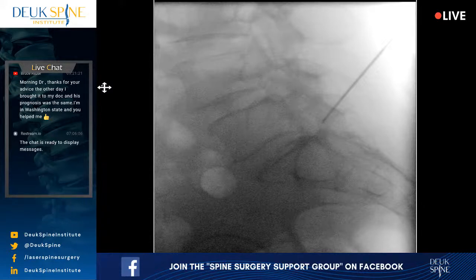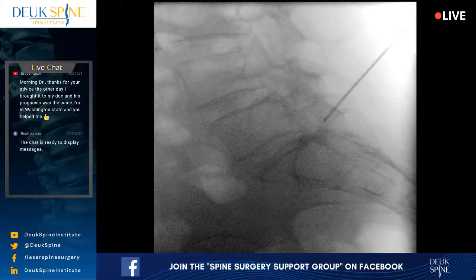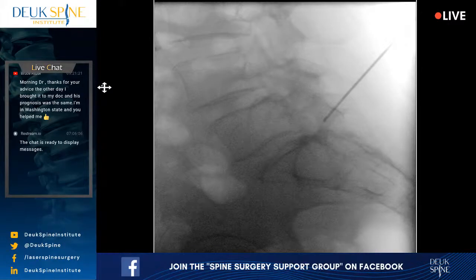I must be hitting the facet. Yeah, that's what it looks like. All right, back to a lateral. You're doing great, by the way. Everything's going well. This is the hardest one to access, the L5-S1. We're very close, and I want to make sure we get it just right.